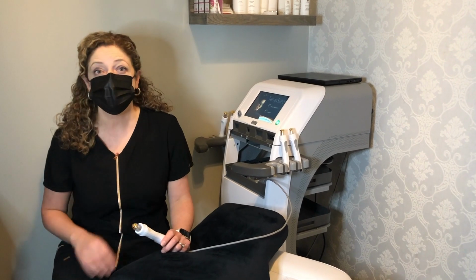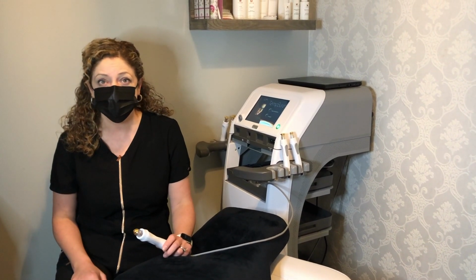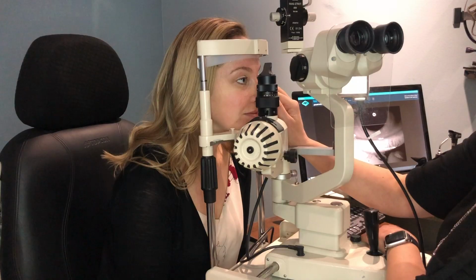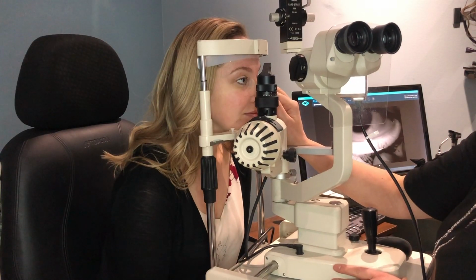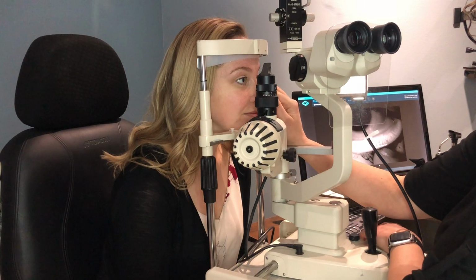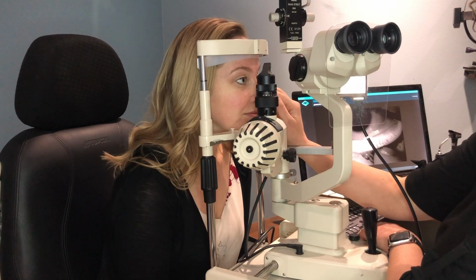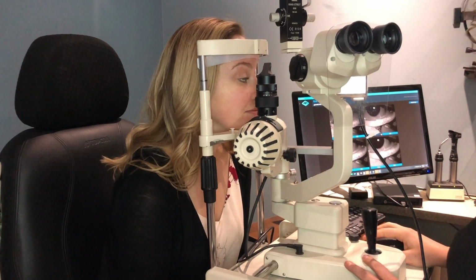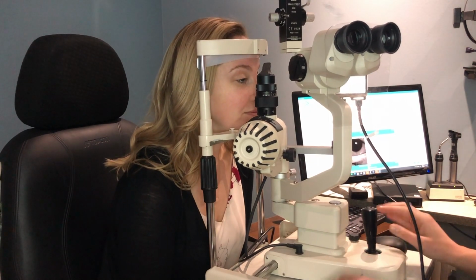So let's talk about this new treatment, what's all involved, and how it can be used to regenerate some of our tears naturally. In an eye exam, we are now able to image, with a special infrared camera, the glands that are responsible for healthy, oily tear production called the meibomian glands. Meibomian gland dysfunction is a leading cause of dry eye disease, and it just gets worse with time.